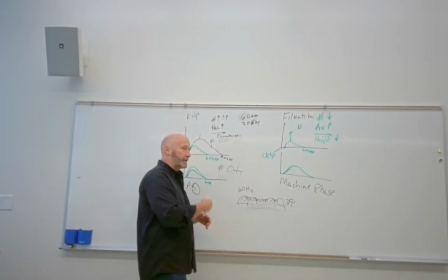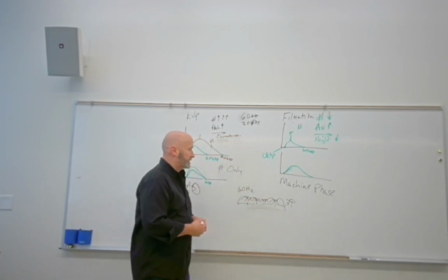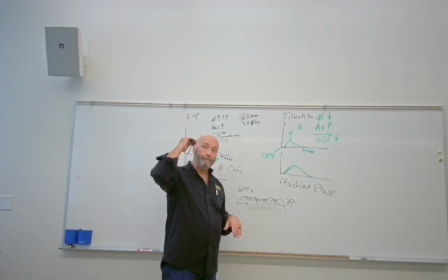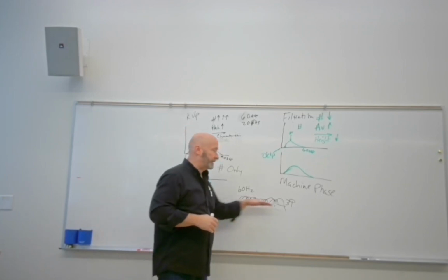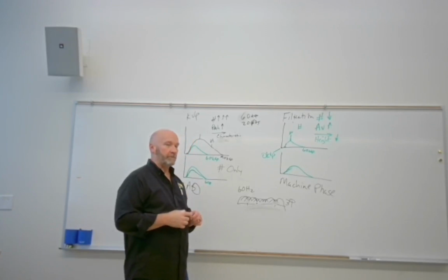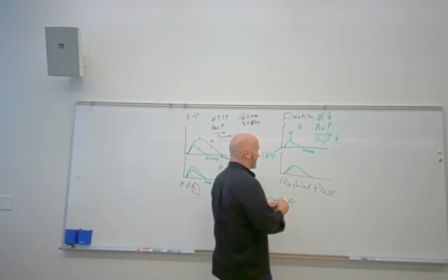So when we rectify it, we get 6 pulses. So we get an increase in output, but because these represent voltage, not maximum voltage, but they still represent voltage, and we've eliminated the minimum voltage, then what's going to happen to our average? And we just said it already, it's going to increase. So what does this represent?